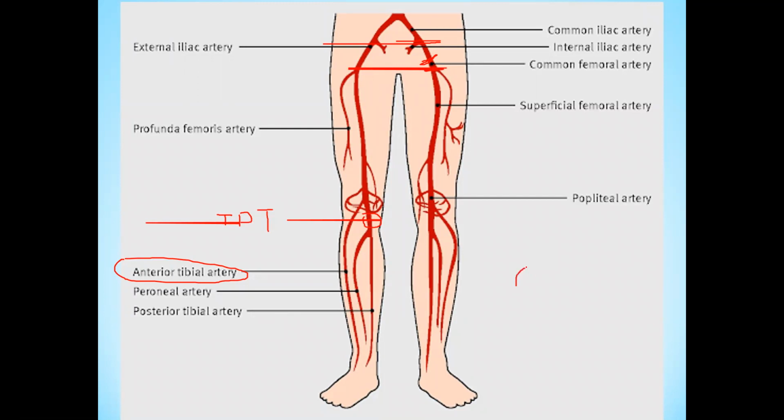Just for example, we are talking about the anatomy of the right side, this leg, okay? So here the vein is large in size and central, accompanied by a lateral artery, small in size and non-compressible.